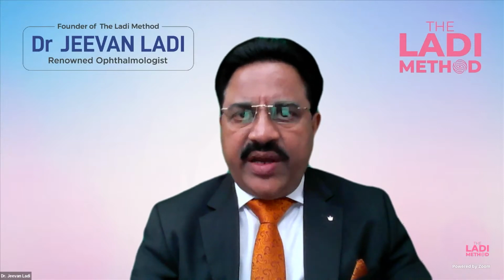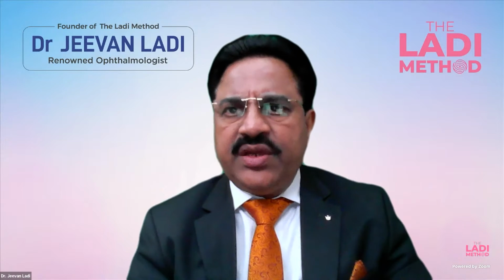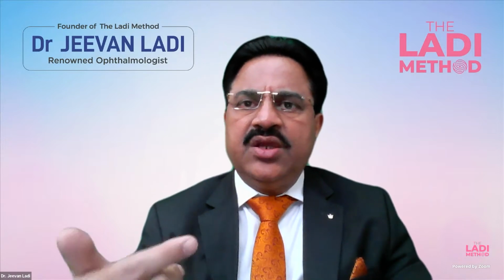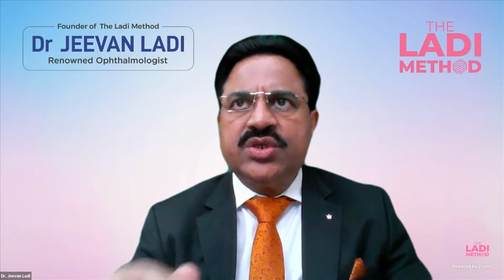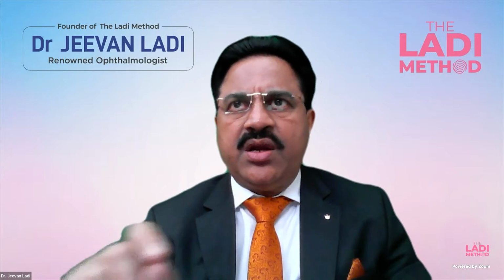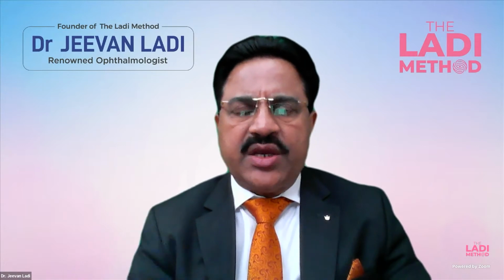You can get it by acquiring also on automated refractive model. And so is there for the keratometry also. So I'm saying that even your keratometry, you should change it to 0.01 settings. So you will consistently get keratometry and automated refractions which are in a range which is more accurate.